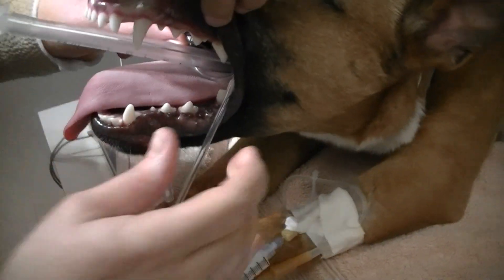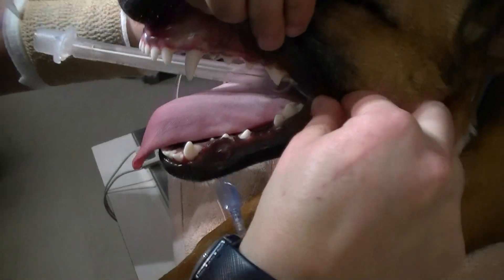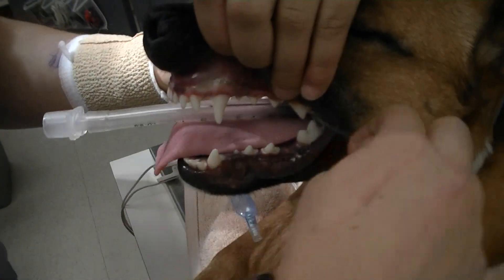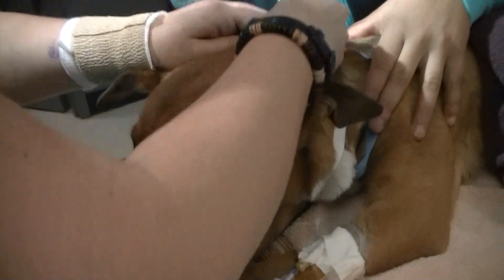The tube tie is placed after the distance measurement is taken. The tube tie is slid all the way to the back of the tube before it's tied behind the ears.